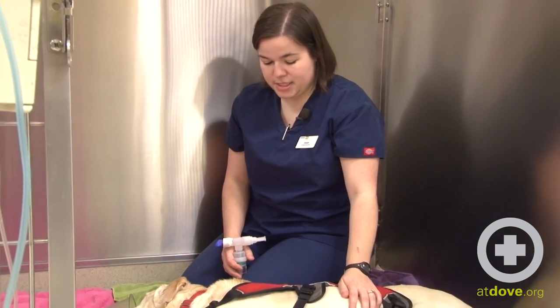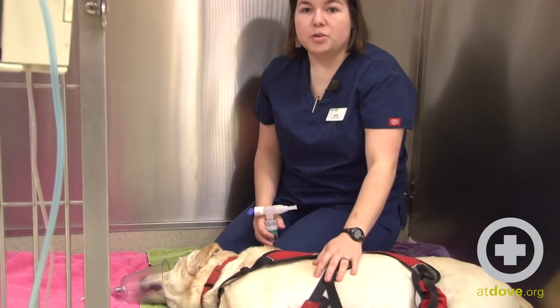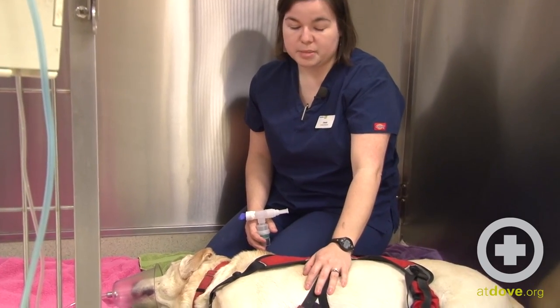Hi, I'm Joanie. I'm one of the technicians here at Dove Lewis. Today we're going to nebulize and coupage this patient with aspiration pneumonia.